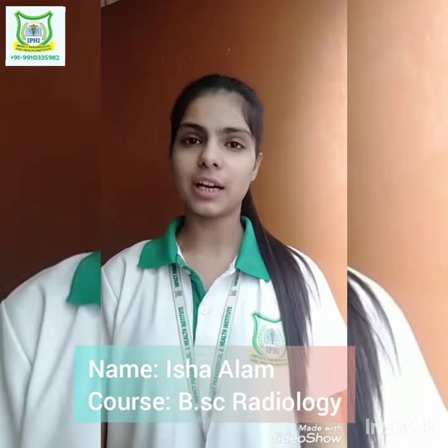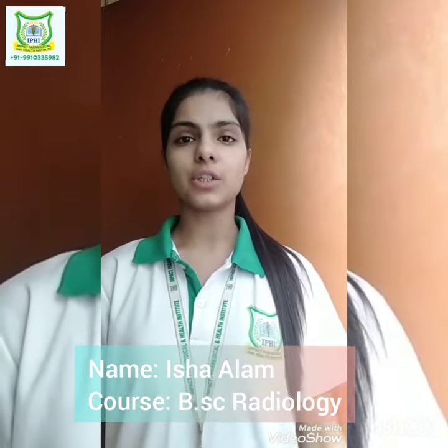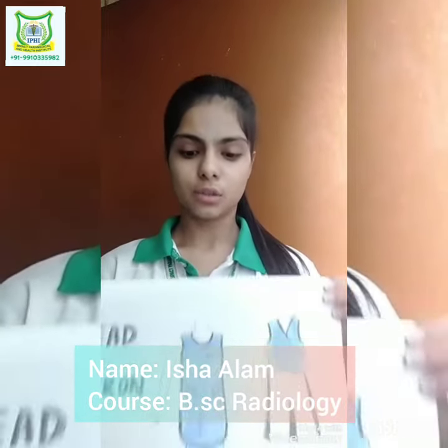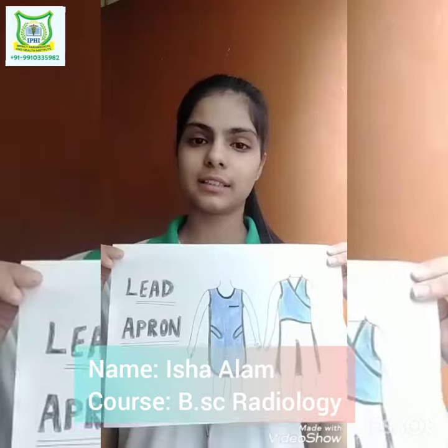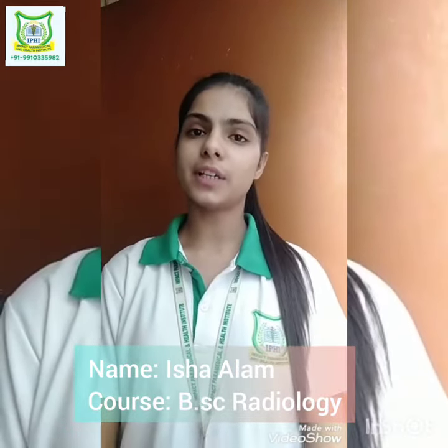Hello everyone, my name is Isha Alam and I am doing BSc Radiology in Impact Paramedical and Health Institute. Today I am going to tell you about the lead apron. This is how the lead apron looks like. The lead apron is a very important part in the field of radiology.